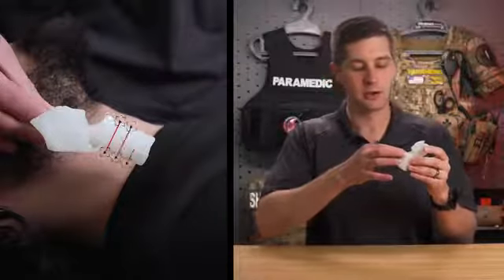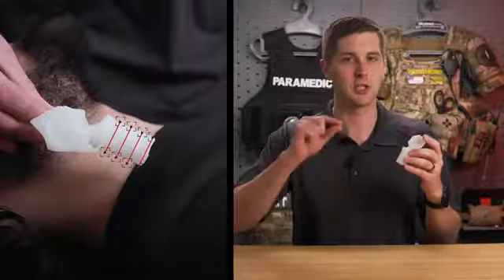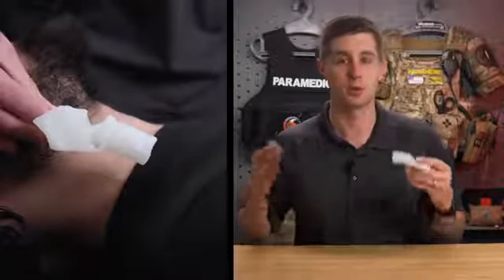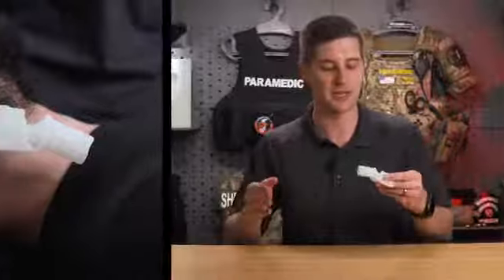These rings are going to be hard cartilage, and then there is some tissue in between them, but it is very hard to insert the tube and can cause more trauma than necessary if that's where you end up accidentally cutting.